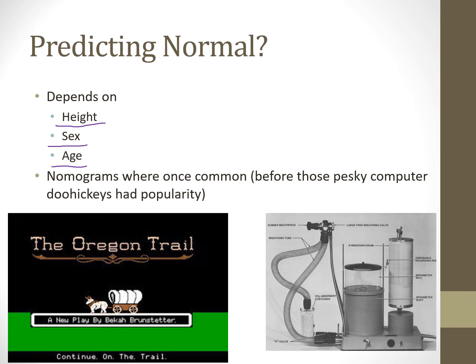And this is where we use something called a nomogram, and that's what we're going to look at on the next screen. These were more common before this whole computer thing happened, which who knows if computers are going to catch on or not.